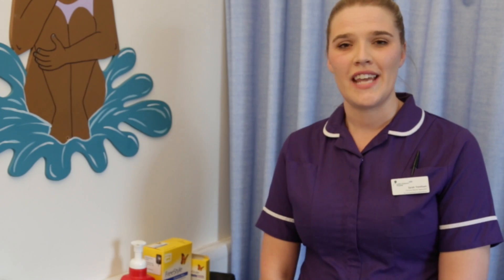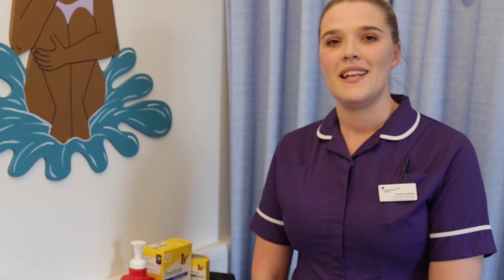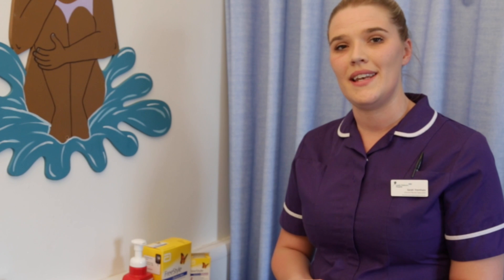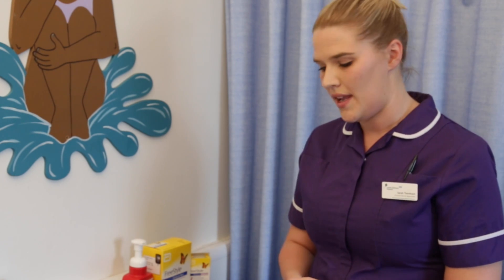We call them blood glucose checks because with diabetes, the only way that we know what's happening inside the body is to do a blood glucose check. We don't count them as good or bad numbers, but each time you check your blood glucose it gives us all the information that we need to make an accurate decision in regards to managing your diabetes.